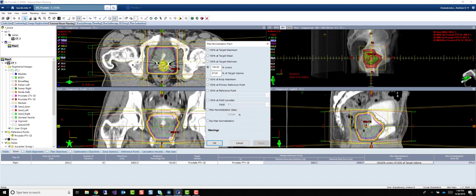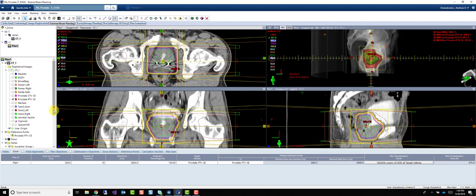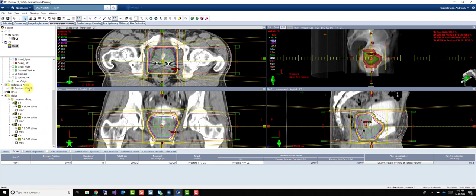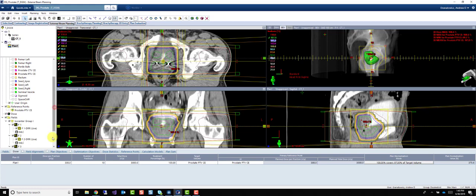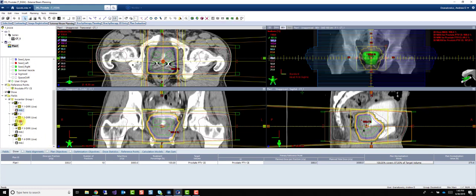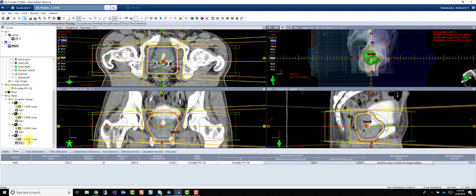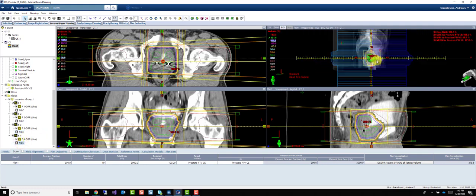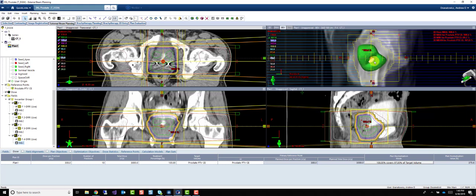Let's try 97. So 97, our 107 is breaking up a little bit. Let's take a look at some of these other angles. I'm going to turn that volume off.